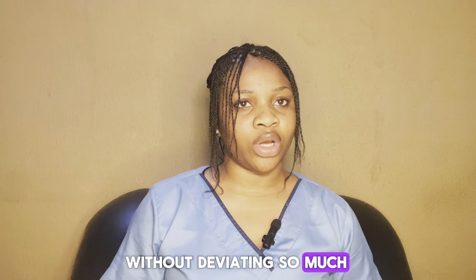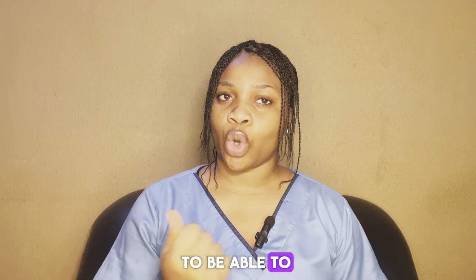Now let me give a scenario. Hello, Mrs. Joe. Today I'm going to be placing a tiny tube into your vein in order to be able to give your medication straight into your vein. You are going to feel a little scratch, but then it's going to get better. You have explained it, so you have told your patient what you want to do, right? We talk about the concept of consent. Here, you are getting verbal consent from the patient to be able to continue.